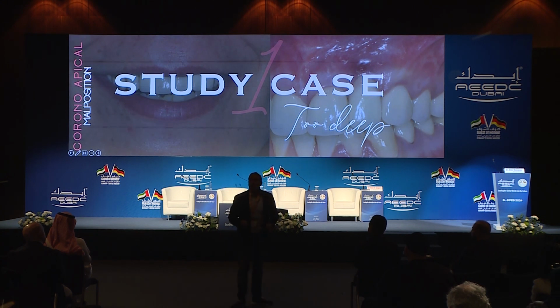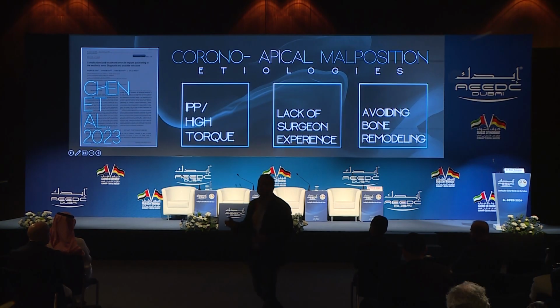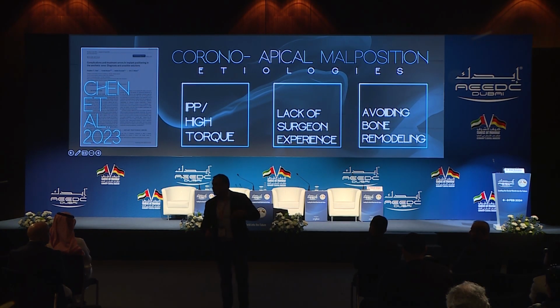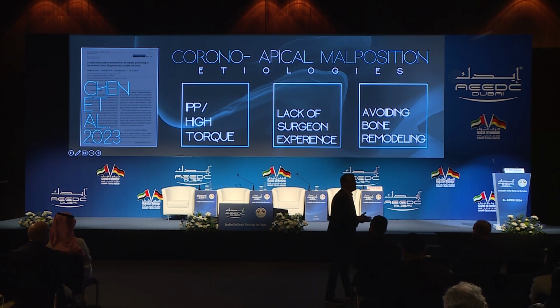The most common complication I see today is deep implant placement. And one of the speakers touched on that point, and the reason why surgeons today place the implant too deep. I always ask people when I'm giving my courses, how deep should the implant be? And I hear so many different answers: 3 millimeters from the bone, 3 millimeters from the CEJ, 5 millimeters from the contact point, 7. Numbers, just numbers.